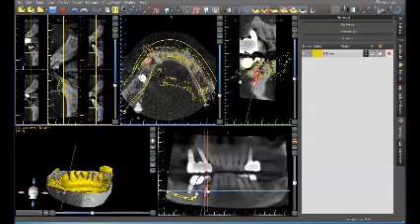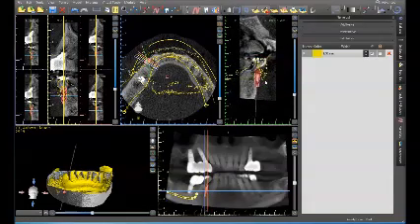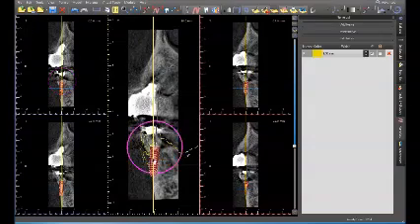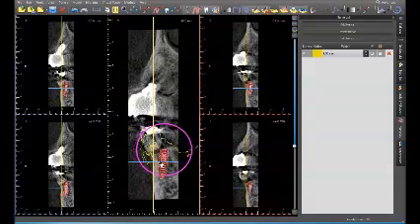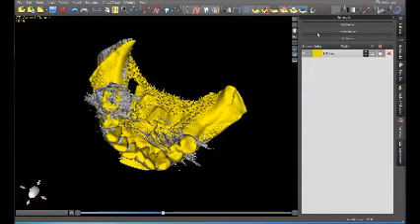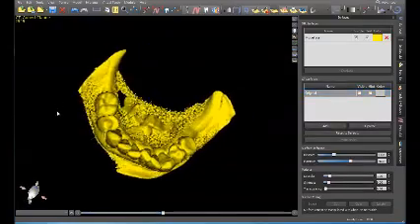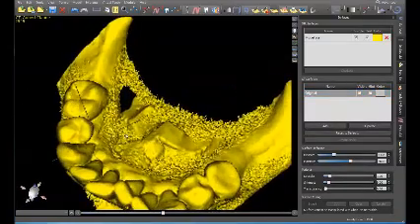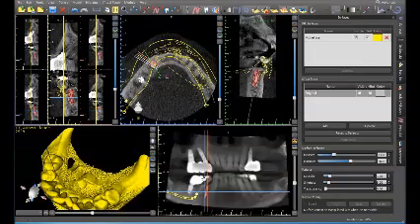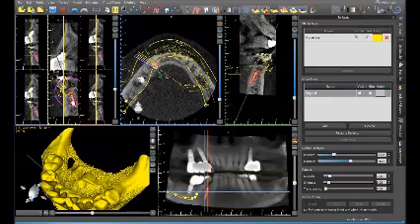You can see I'm out of the bony housing a little bit, so I need to make some changes. And looking from an occlusal view, let's turn the surfaces off. So this is coming out real far lingual. You can see it here, change view. That's where I'm looking as I'm rotating this.